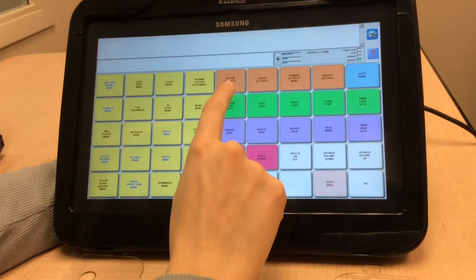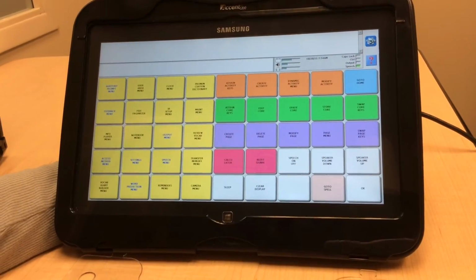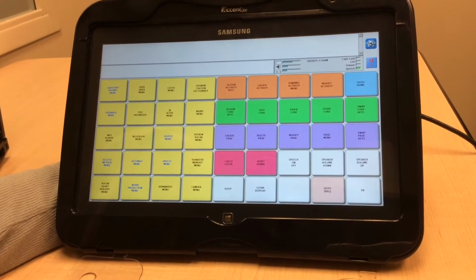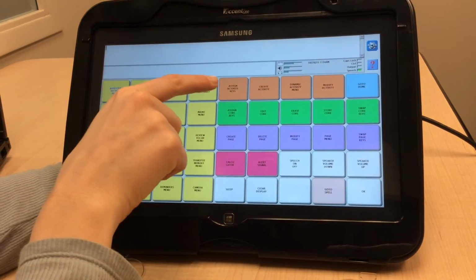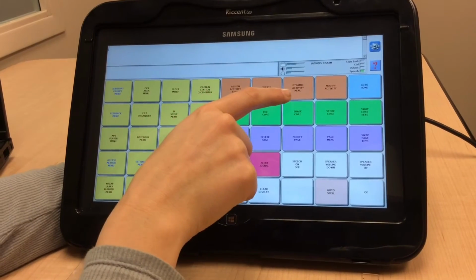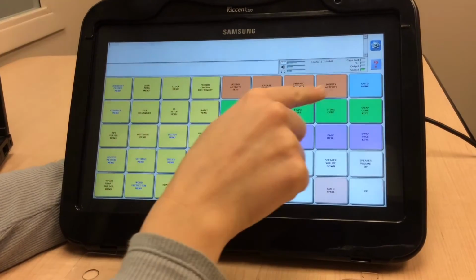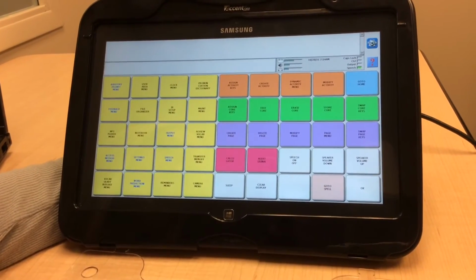So at the top, you can see we have some orange buttons. That's in regards to activities that are available. You can be looking at things pertaining to the client themselves, things they like to do, etc. So we have assign activity keys, create activity, dynamic activity menu, and modify activity. Those are all buttons you can select to change the activity or add one to the device.